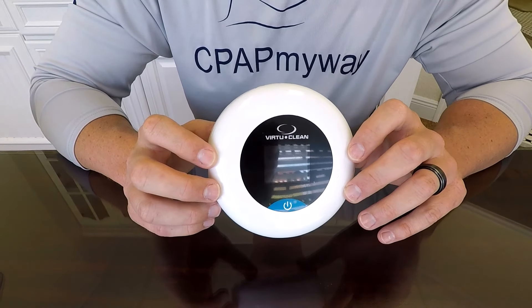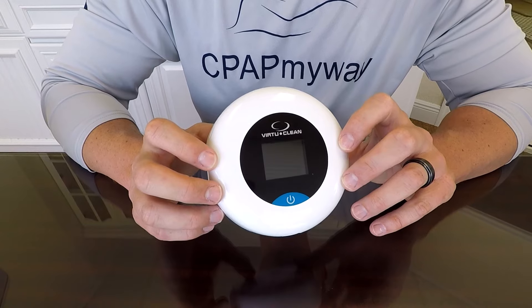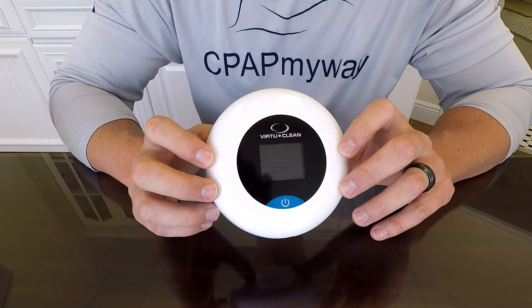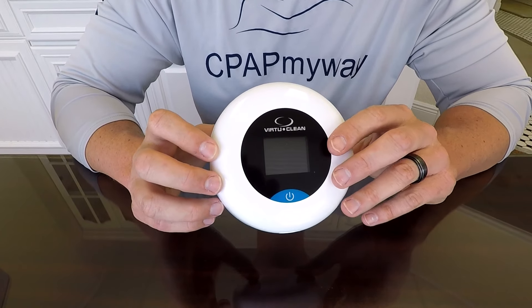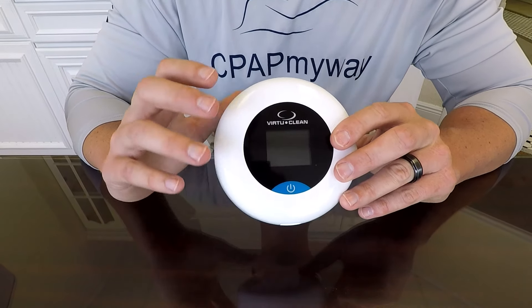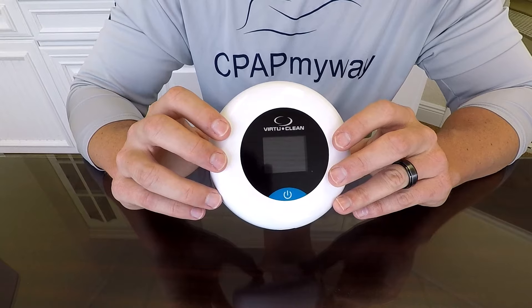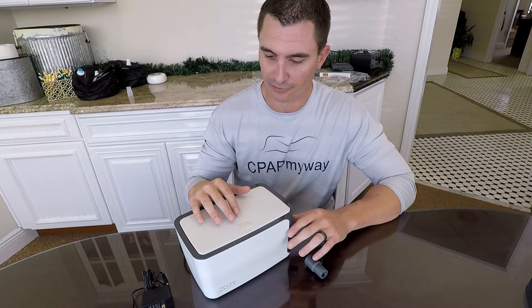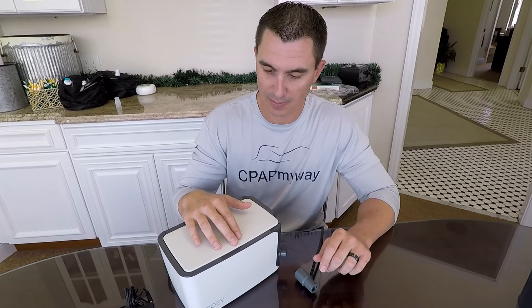The Virtue Clean takes about 30 minutes to thoroughly clean and ventilate the CPAP supplies in the bag, so it's a pretty quick process. It's one of those things you'll probably set up before you leave, let it run through, and it'll be finished and ready to go by the time you get home.